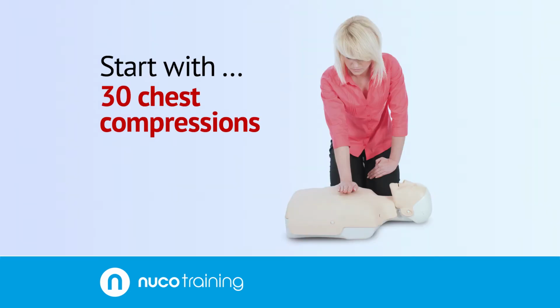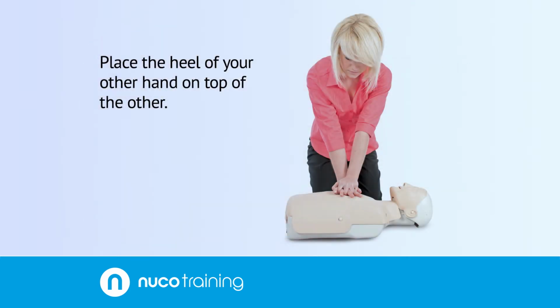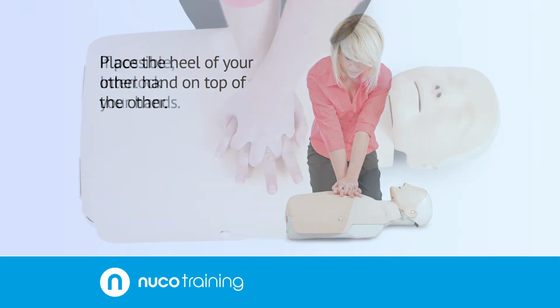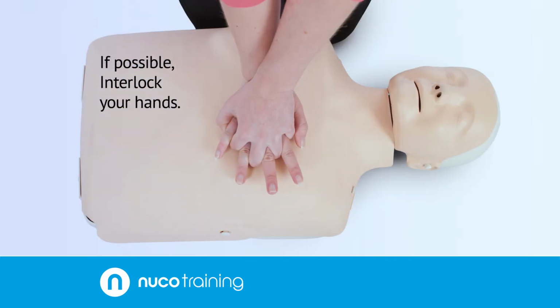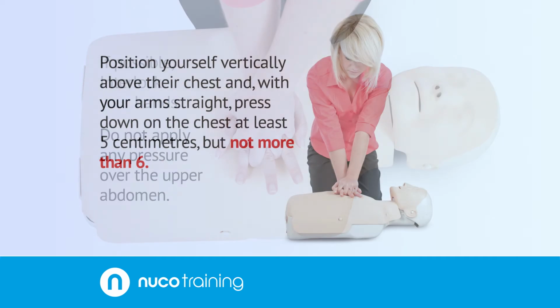Start with 30 chest compressions. Kneel by the side of your casualty. Place the heel of one hand in the center of the casualty's chest. Place the heel of your other hand on top of the other. If possible, interlock your hands. Do not apply any pressure over the upper abdomen.